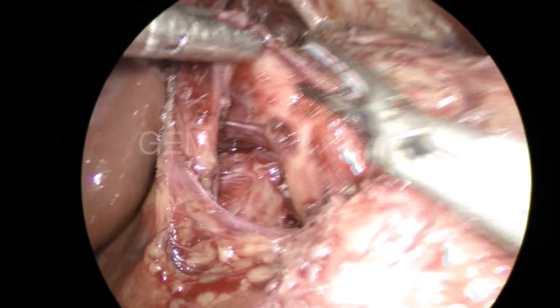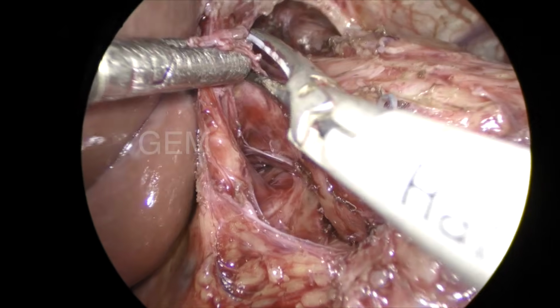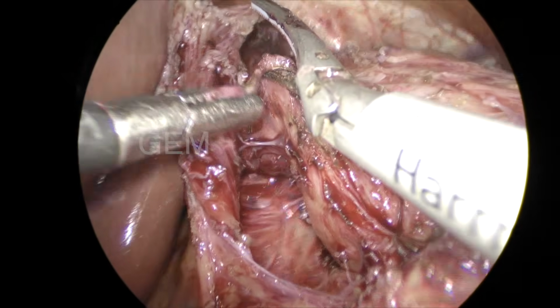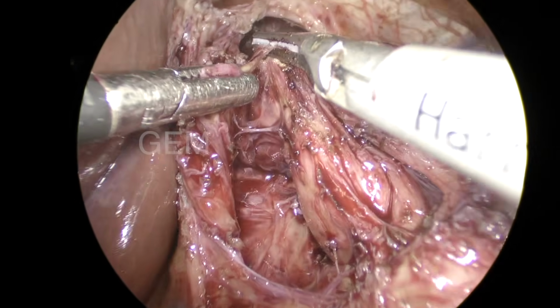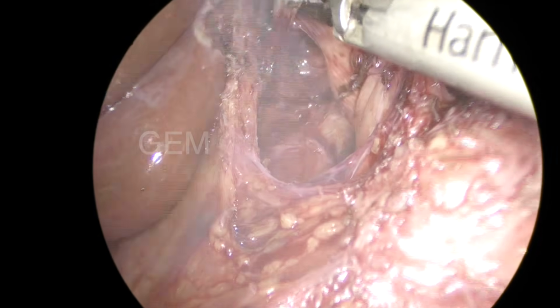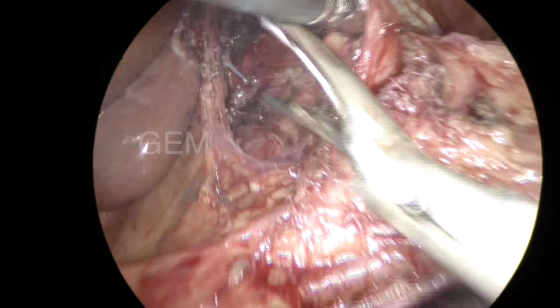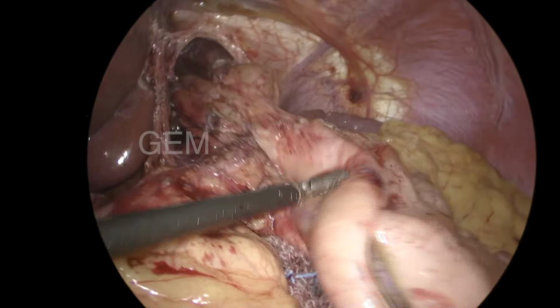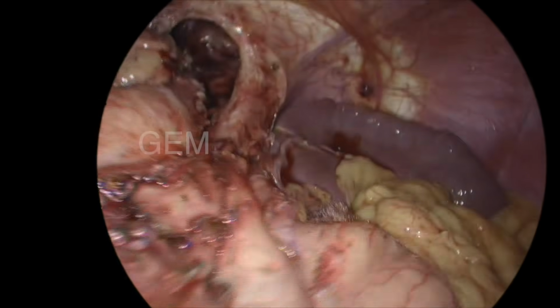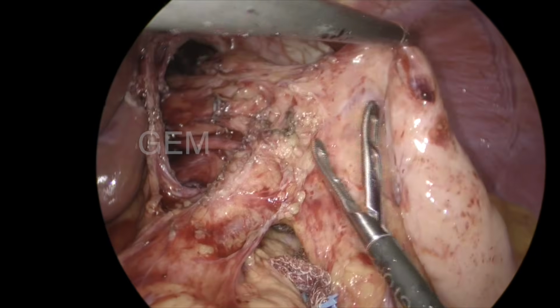I do not want even a small serosal tear, because we are pulling now, and it will be stretched. It looks like a band. If you divide that fibrous tissue or band, it will make a hole in the stomach. Now the small attachment is there; you can see the fundus stomach wall and the fibrous attachment. So it is completely divided. I am checking on that side.